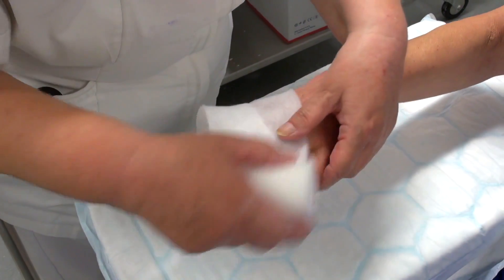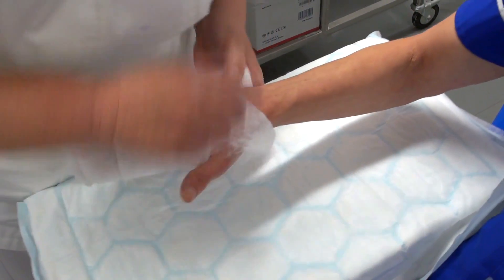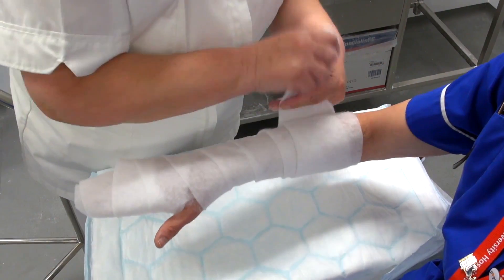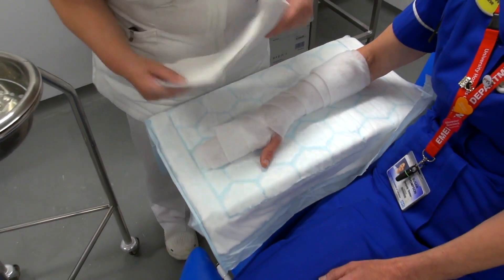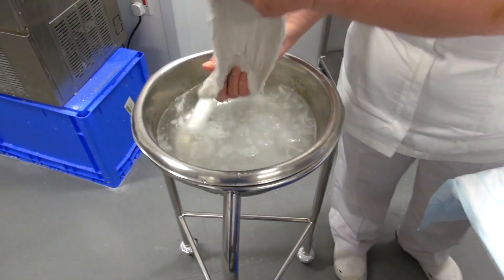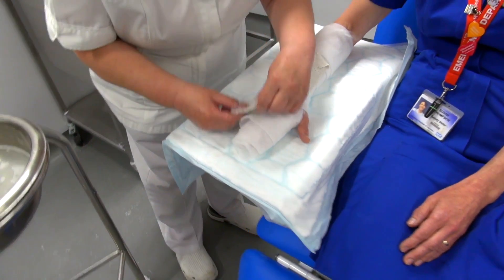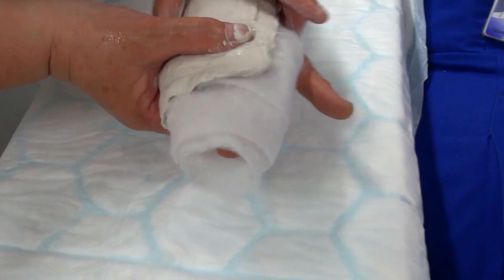Bring it round as normal. Wet your plaster — don't get it too dry. You pop it on. With the other finger, you just need to find the end of the finger, and you want to go just on the nail so you can be able to see it.